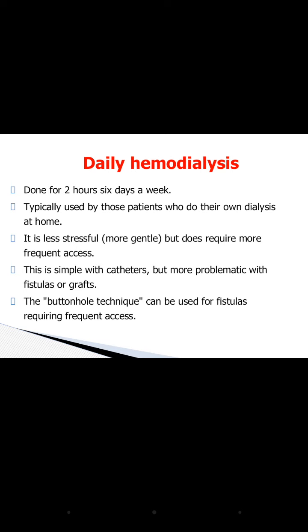It is less stressful, more gentle, but requires more frequent access because we are performing it daily, so there is a requirement of frequent vascular access. This is simple with catheters but more problematic with the fistula or the graft. Obviously, if there is a catheter, daily hemodialysis is easy, but with a fistula or graft it is a problem.